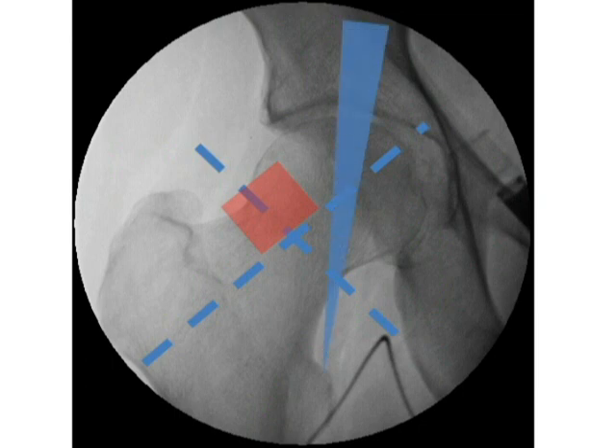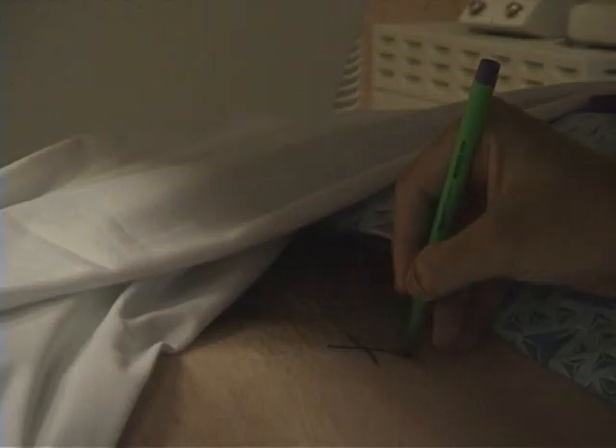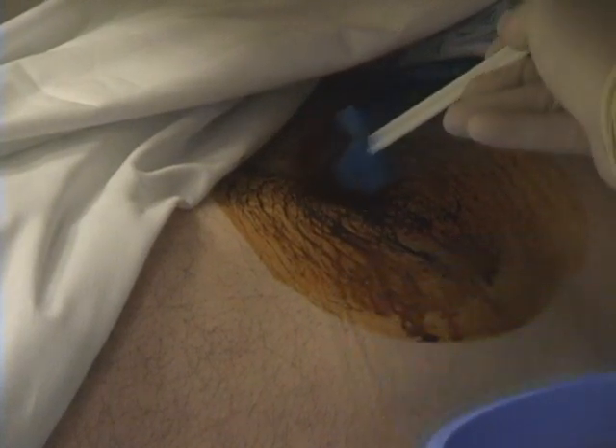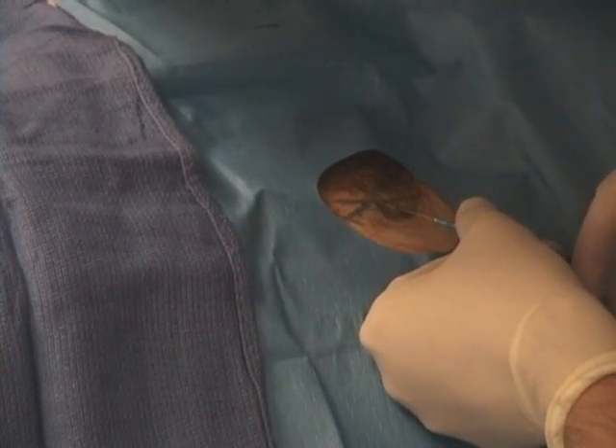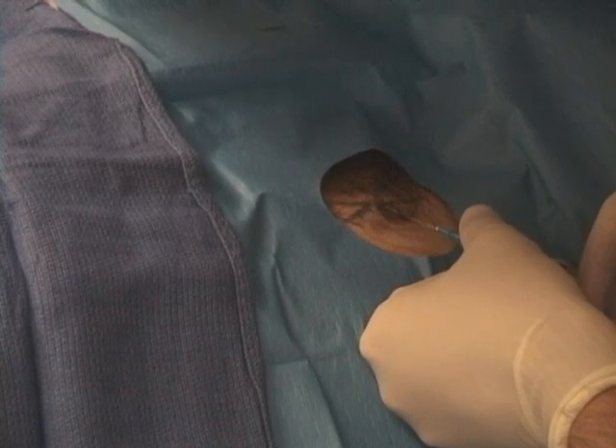By choosing this point, we will be avoiding the iliopsoas tendon and the femoral vessels. You can mark your access point with a pen and then prep the site just as before. Finally, place the sterile field over your access site. Administer lidocaine in a similar fashion — first a sub-q bolus, followed by a deeper amount of lidocaine.